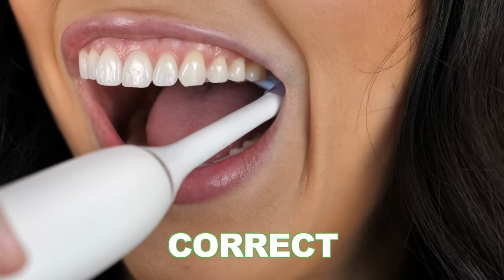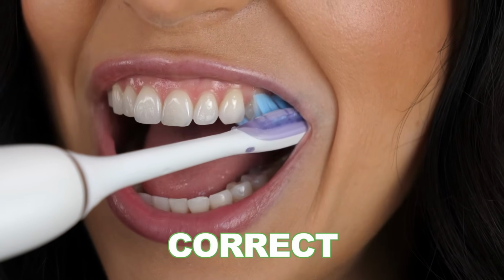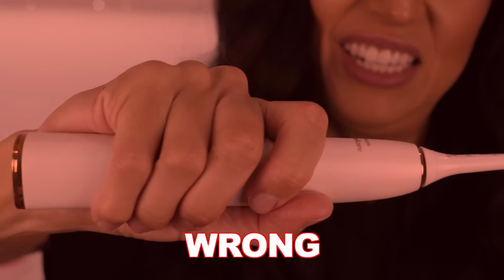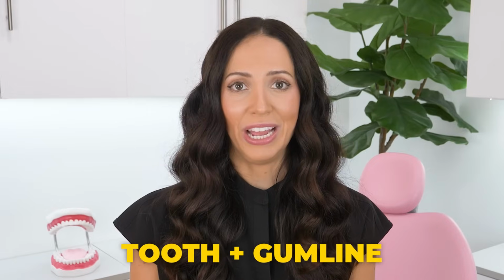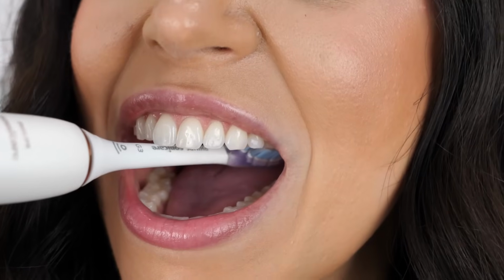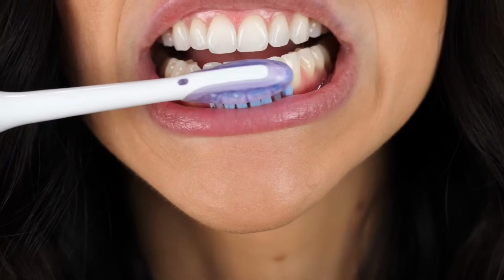So you guide it along your gum line, and like I said, keep in mind that the goal with electric toothbrushes is to let them do the work for you. Also, the harder the better with brushing is not true. So keeping all of that in mind, with a gentle, soft grip, make sure that the brush is touching both the tooth and the gum line. Then you just follow along your gum line on all the fronts, backs, and tops of your teeth. It's also a good idea to angle it slightly toward the gum line. So on the top teeth, angle it up a little, and on the bottom teeth, angle it down a little.